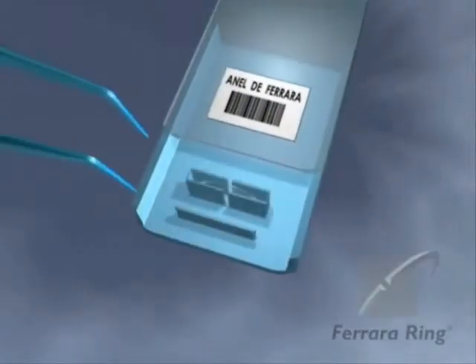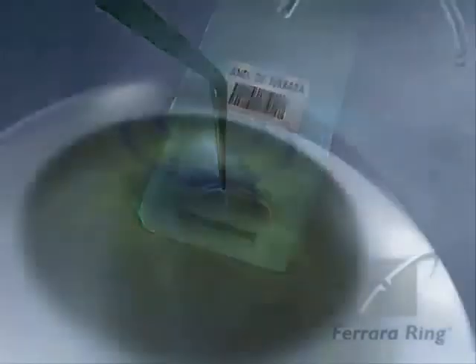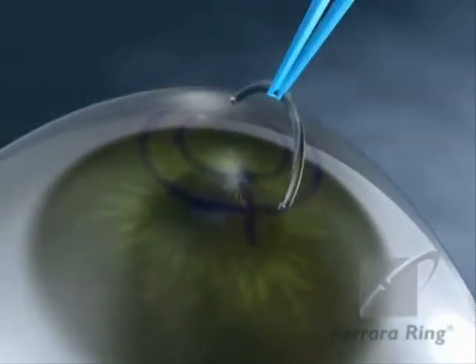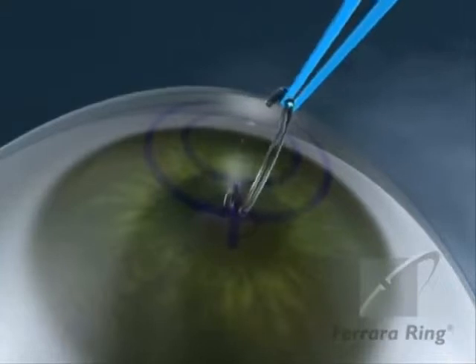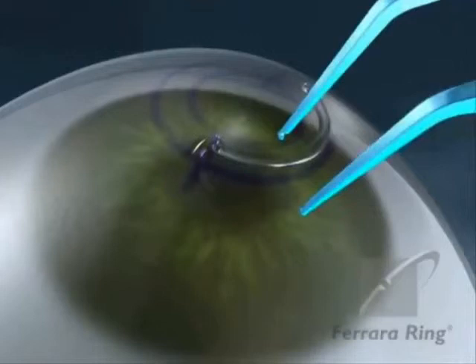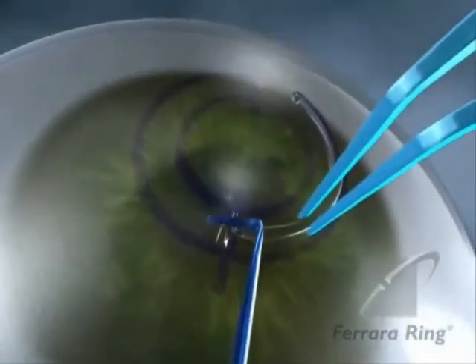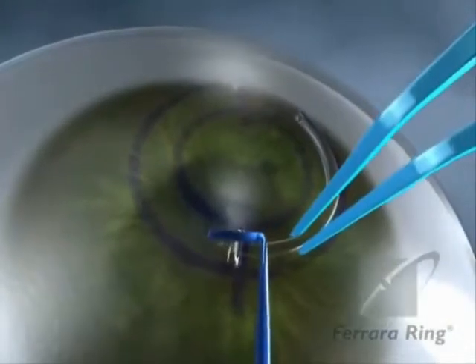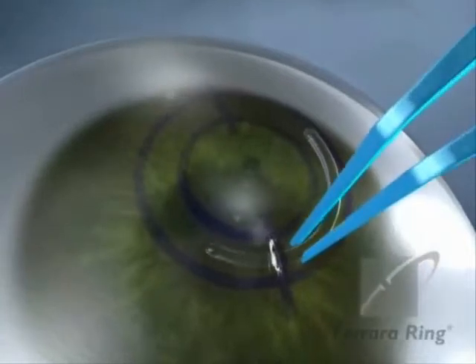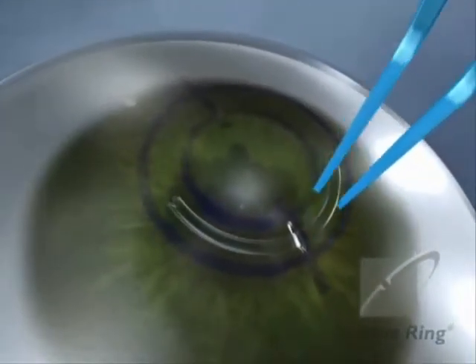Remove the Fahara ring from its case using the modified McPherson forceps. Place the ring over the eye, ensuring that the flat side of the ring is downward. Hold the ring with the McPherson forceps at one-third from the end to be implanted. Introduce the ring into the tunnel beneath the guide, then remove the guide without releasing the ring. Using short movements, introduce the ring into the tunnel until only the tip and orifice remain exposed.